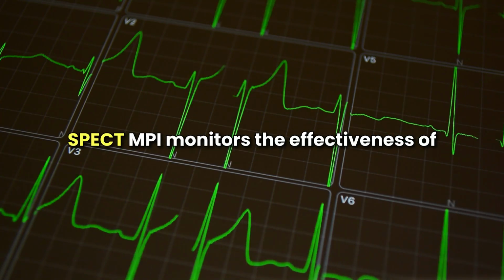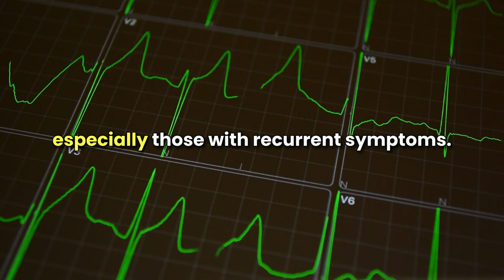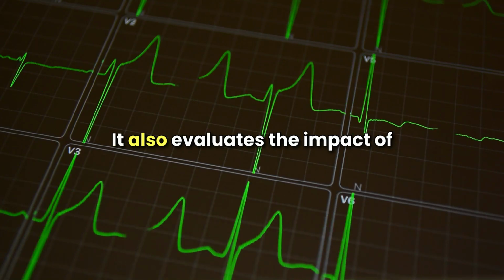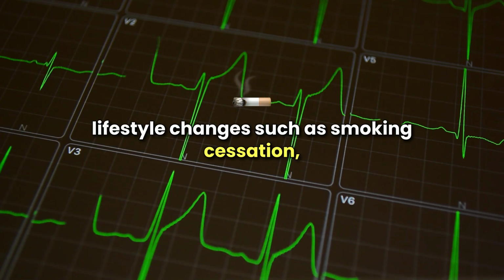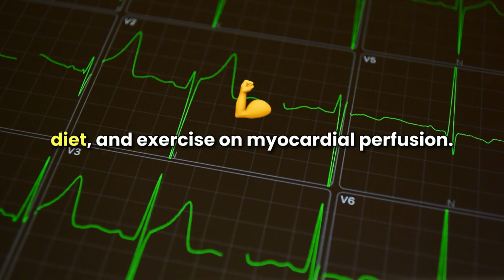SPECT MPI monitors the effectiveness of medical therapy in patients with CAD, especially those with recurrent symptoms. It also evaluates the impact of lifestyle changes, such as smoking cessation, diet, and exercise, on myocardial perfusion.